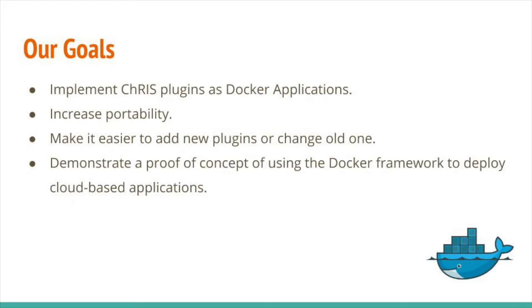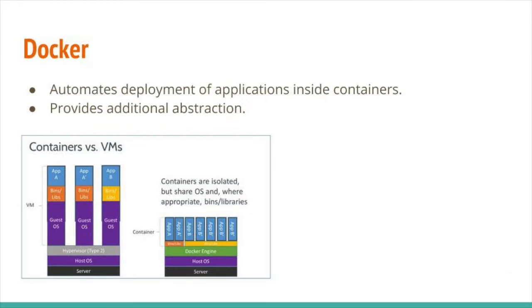What we want to do is to add Docker functionality to CRIS. Docker is a container framework which automates deployment of software by providing operating system level virtualization. It puts everything your app needs into a container. You can choose the operating system, the binaries, the plugins, pretty much anything you'd like. It also works on the write once, run anywhere model, which would allow easy deployment of CRIS across multiple clusters.